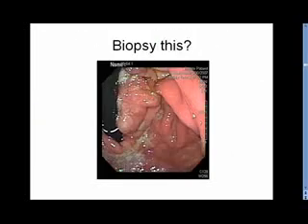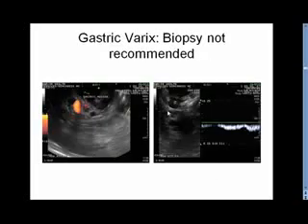This is a patient who had another submucosal abnormality which required evaluation. This was a patient with an operated stomach. At the gastroesophageal junction, a submucosal mass of this type was seen. It was not clear what it was. Fortunately, we did not biopsy it, because on a subsequent endoscopic ultrasound it turns out that this was an isolated gastric varix. Not exactly sure what the etiology is.